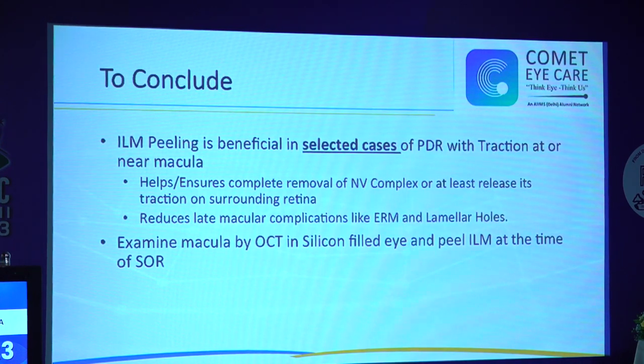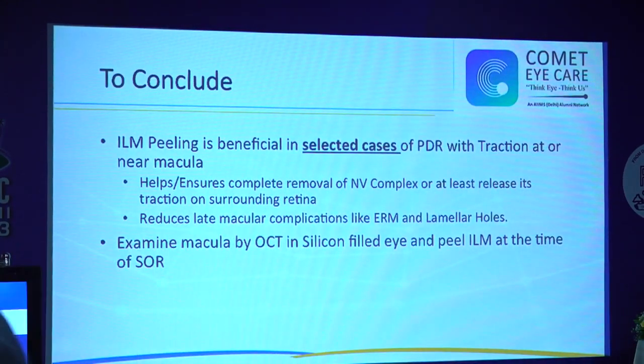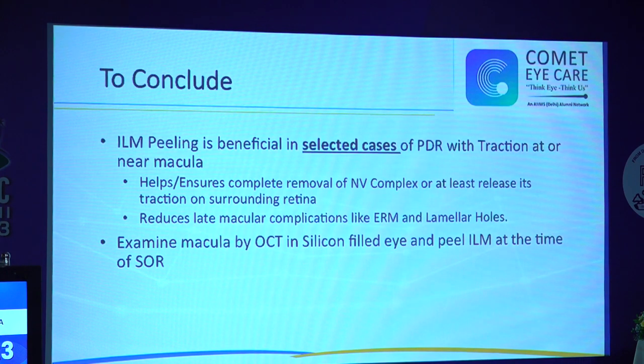And a useful tip is to examine the macula by OCT in silicone oil filled eyes and peel the ILM at the time of SOR if required. So in some cases, it can be done later too.